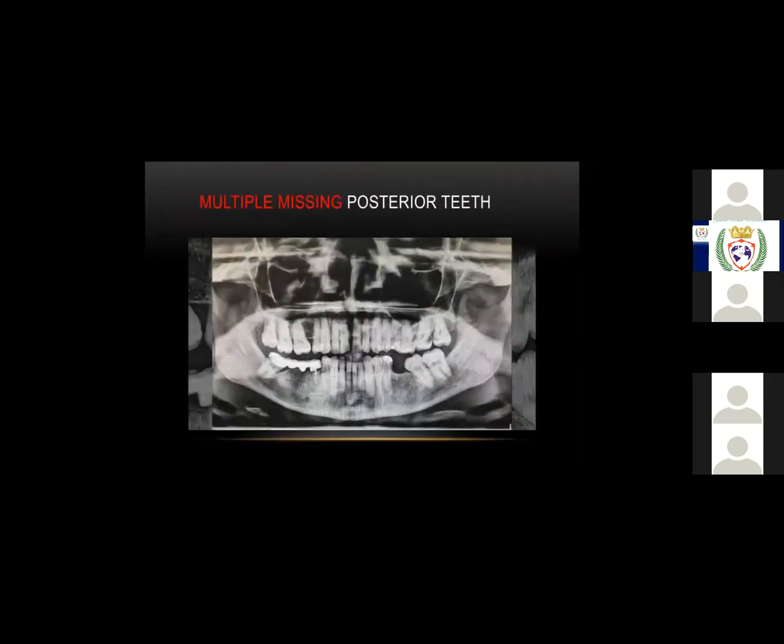So sometimes we'll have cases where we have multiple missing posterior teeth, where we have different types of scenarios. So we have to take up sometimes a delayed implant situation in one area and immediate implantation in some areas. Especially in this case, in the fourth quadrant, you can see a failing fixed partial denture.